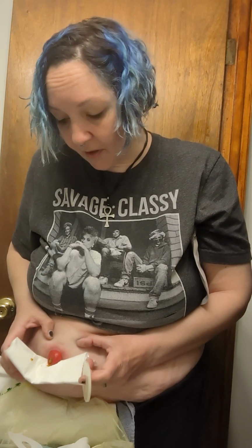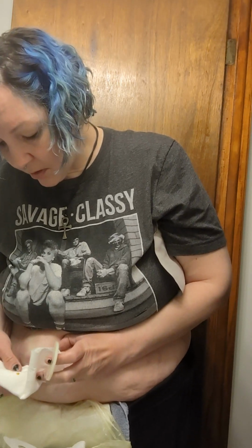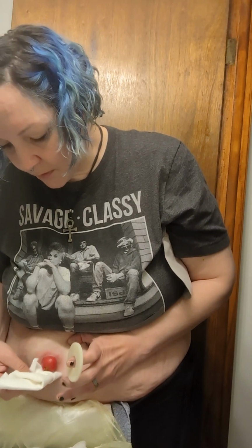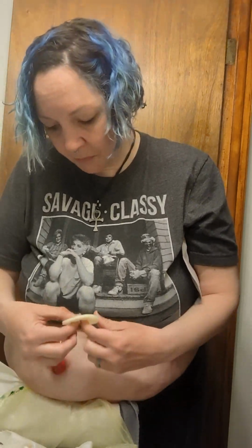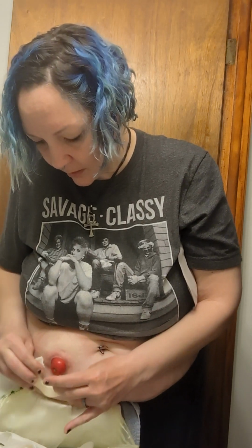All right, now when she goes to the bathroom, I can't feel it. I can't feel a thing. I can touch her, it's okay. I feel nothing, but I can tell that she's about to go if I see her moving. So if you're about to get a stoma, pay attention to the movement it's making.